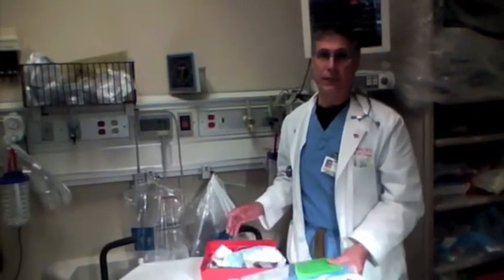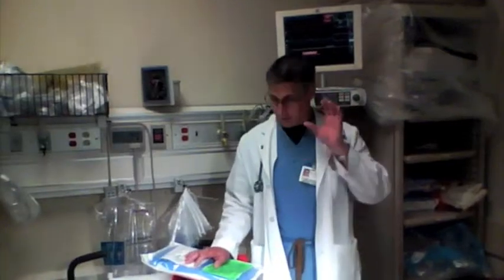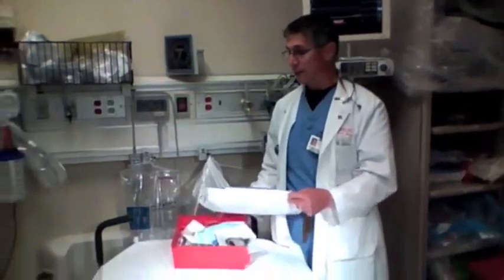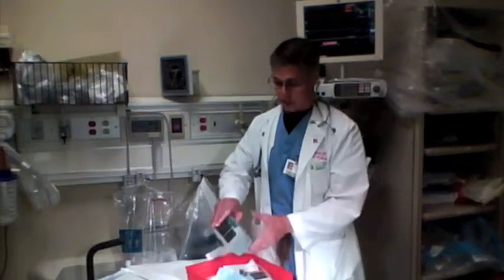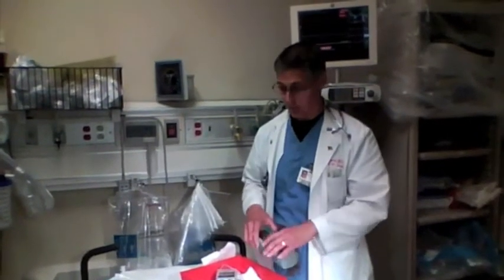We're going to talk about placing pacemakers. The key to placing pacemakers is it's nothing more than putting a CVP in somebody and floating a wire into it. All the equipment for the transvenous pacemaker is in the critical care cabinet beside resuscitation room V. When you look in the cabinet, this is what you're going to find. This is the pacer kit — it comes in a blue kit like this. There's also a red tray with the pacer boxes. These are the two pacer boxes — basically they're generators that generate the pulse for the transvenous pacemaker.